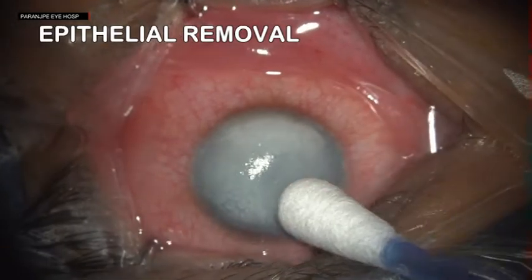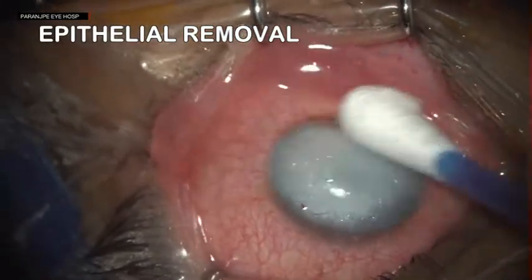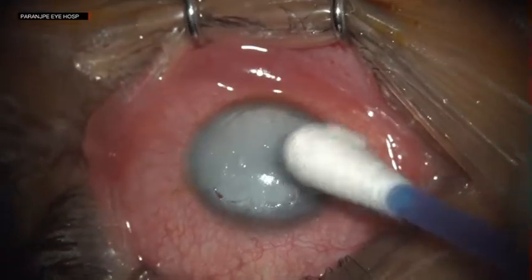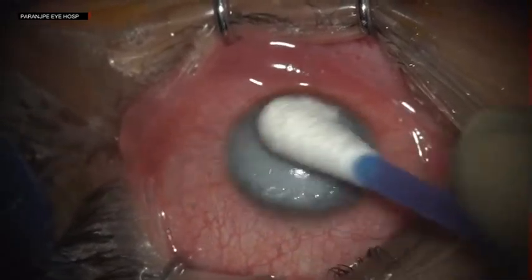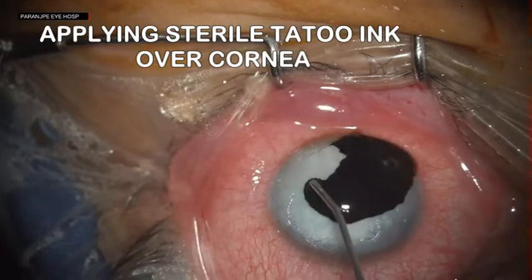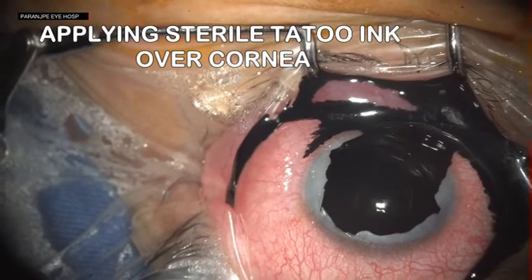After the epithelium is debrided in a major part of the cornea, tattoo ink — which is a sterile ink — is applied on the cornea and spread evenly.